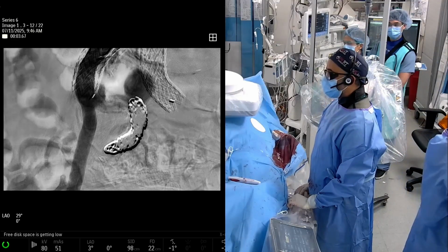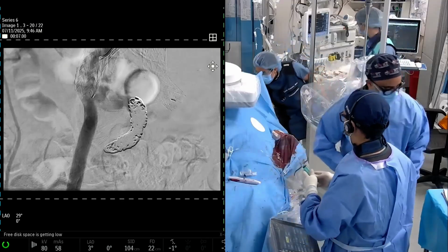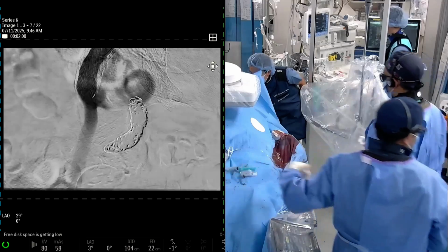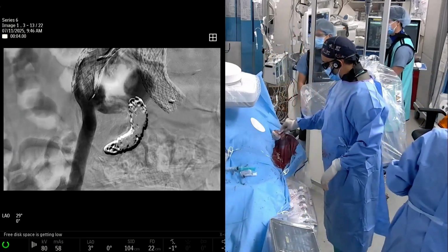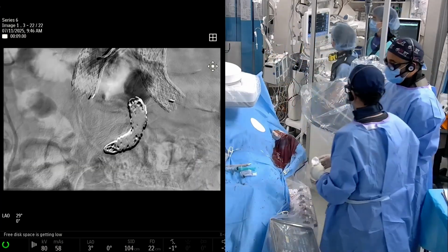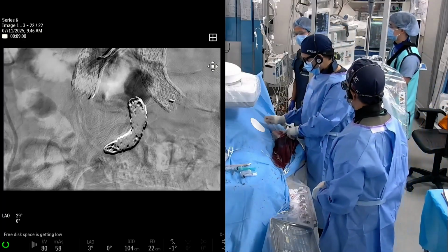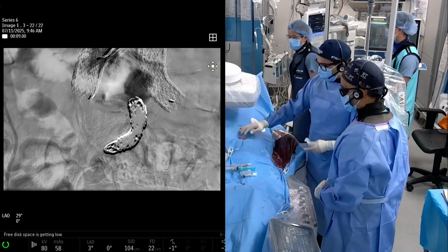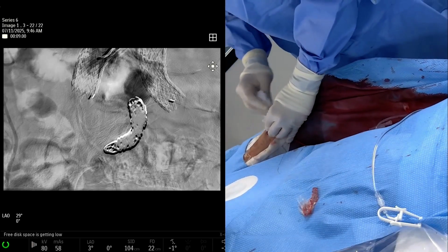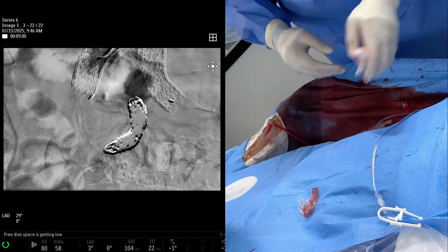Different sizes of TR bands. So we use TR bands. There are obviously a whole bunch of different manufacturers that make these sort of radial closure devices. But the Terumo TR band comes in two sizes. It's regular and large. I can't think of any patient who's ever needed something bigger than a large. Yeah, the large is pretty big. Pretty high up the arm. Unless you get sheath super high up the arm, which I personally would not recommend doing, just because you have to stay over the bone.